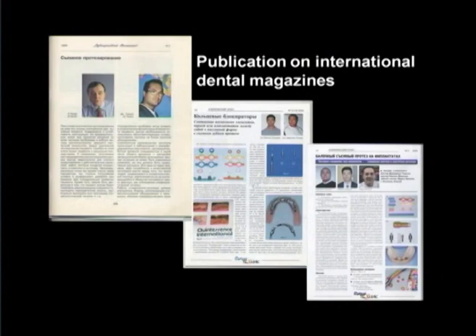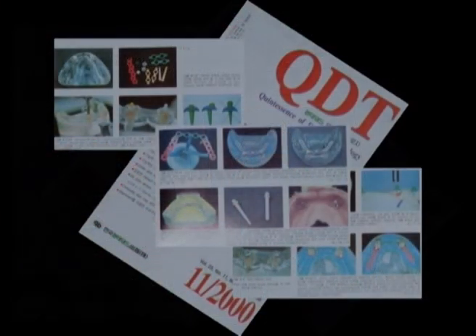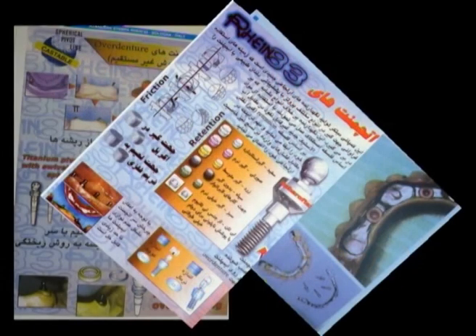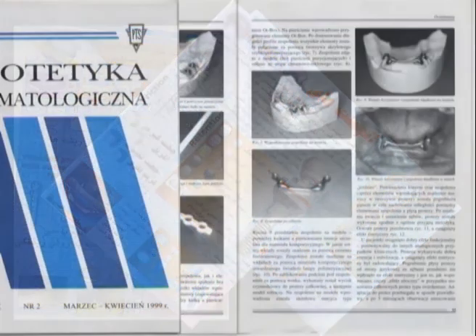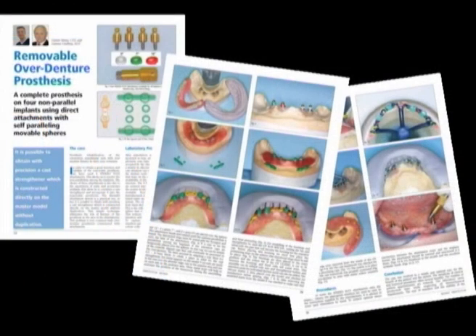With the variety of these shown cases, we want to point out that the annular block technique is good to solve many situations, from simple ones to very complex ones, just using prefabricated castable components to simplify procedures. Any metal alloy can be used for the cast.